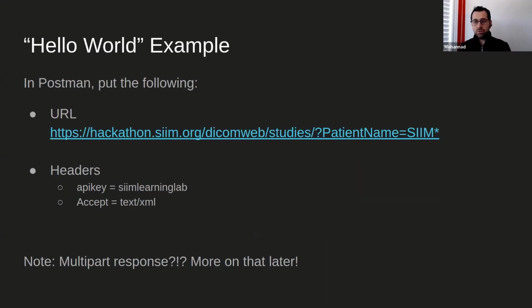So what I'm going to do, and all of you are more than welcome to try and attempt this later at your leisure, is try to do this in an application called Postman. Now, you can do this in a variety of ways, but I like Postman because it allows you to explore these web-based APIs in a nice generic fashion. And as you'll see, it has a cool feature where it allows you to basically tinker and figure out the mechanics of the request you want to put together, and then you can quickly export that into code.